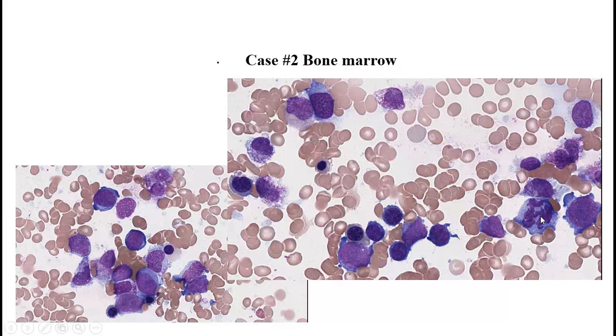There's a mitotic figure here. There's also an early cell, could be an early red cell, and definitely there's a blastish-looking cell. So looking at that, because of these cells that are here, it is quite concerning. The cells that have granules in there are not truly myeloid elements.